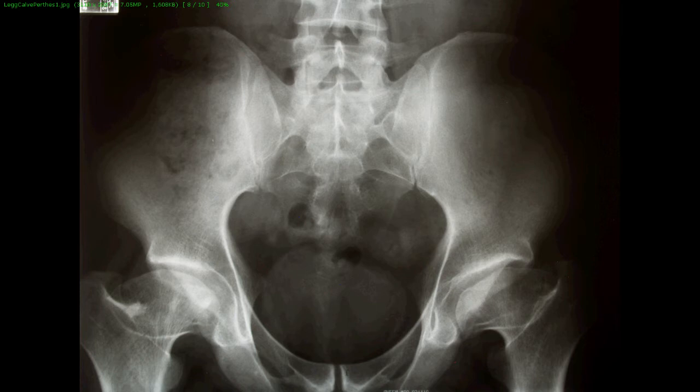The hip joint spaces are relatively well preserved and symmetrical, although there does appear to be a bit of widening bilaterally in the medial joint compartments themselves. I suspect this is secondary to the deformity in the femoral heads rather than any suggestion of any swelling within the joint. The fat pads surrounding the hip capsules are well visualized and don't seem to suggest any joint effusion.